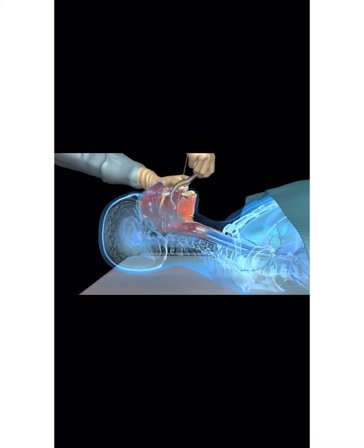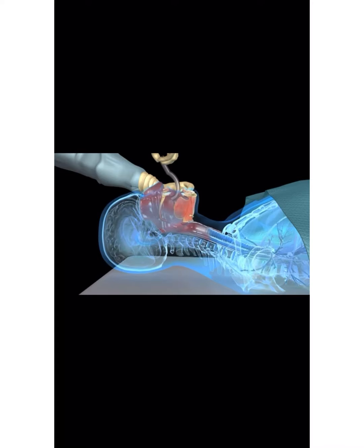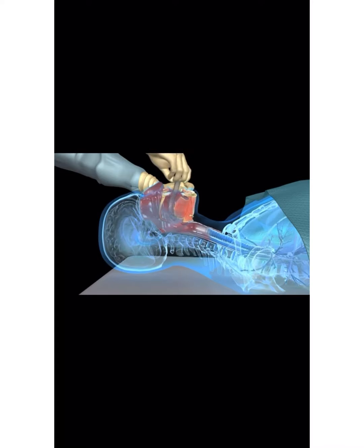Use the curvature of the oropharyngeal airway to insert it into the oropharynx. An alternative way is to insert the oropharyngeal airway in reverse and rotate it 180 degrees while it is inside.